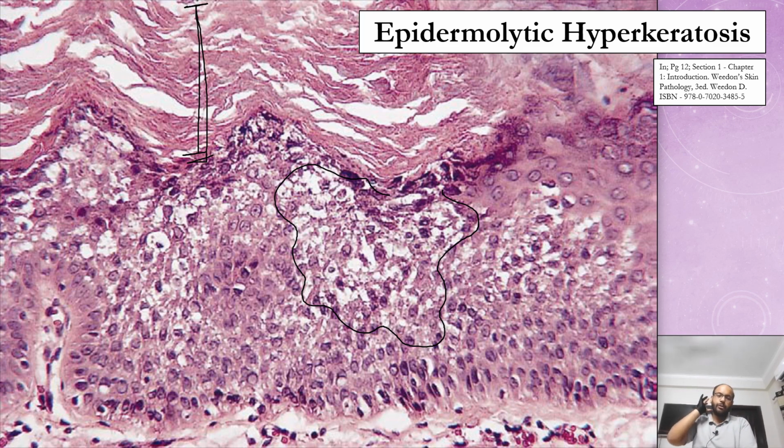Now, epidermolytic hyperkeratosis occurs in a variety of different disorders. It can be localized, generalized, severe. All those clinical disorders can present with epidermolytic hyperkeratosis. It can in fact be an incidental finding also. We'll discuss epidermolytic hyperkeratosis in future videos where it plays a much more important part.